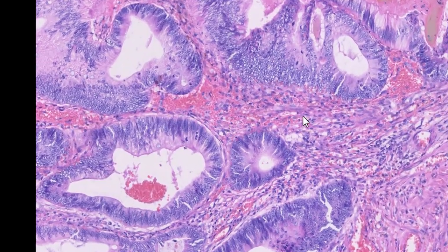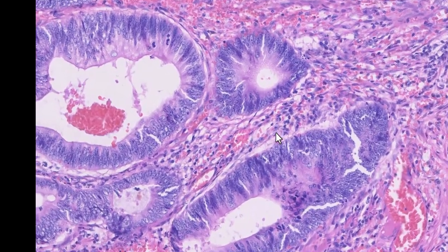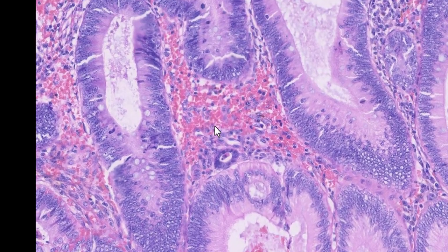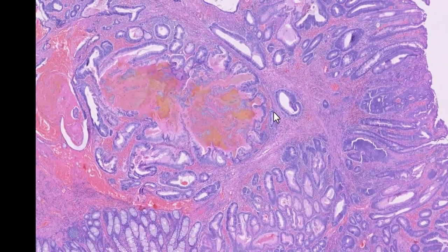Three, look at the stroma. Doesn't this look like lamina propria? Perhaps it's not exactly the same. So there it is here. And let's compare it to what's going on here. It's not that different, is it? Four, oh, I don't remember whether it's 3 or 4.